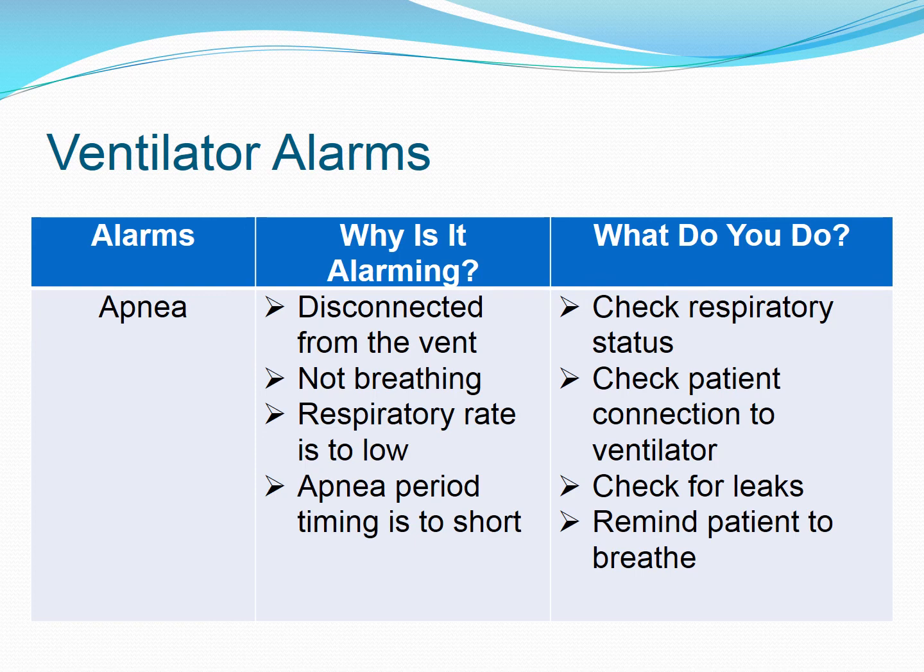The apnea monitor is another alarm that can go off. So you really want to look at your patient, because when the apnea alarm goes off, what that means is the patient's not breathing or the respiratory rate is low. So you really want to look at your patient to see if they're breathing or not breathing. Sometimes this happens too because they do get disconnected from the ventilator. So you do need to think about that. So check your patient to see if they're breathing, and also make sure that everything's connected correctly. And sometimes you just have to say to your patient, breathe.